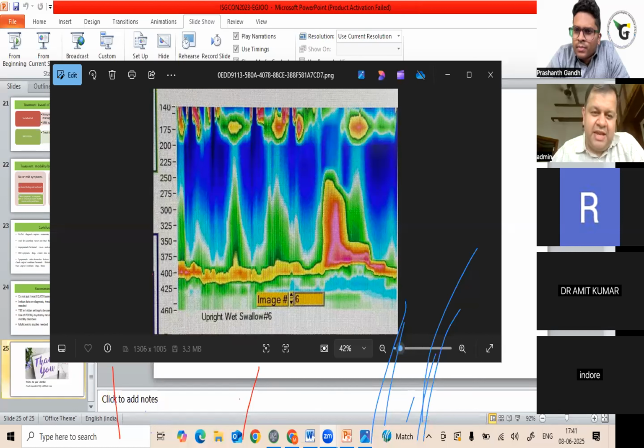Secondly, if there is significant central obesity, the patient is wearing very tight-fitting clothes, or the patient has a significant hiatal hernia, sometimes the manometry probe can get coiled in supine position, which usually, as we turn the patient into upright position, can straighten out, leading to correct measurements.